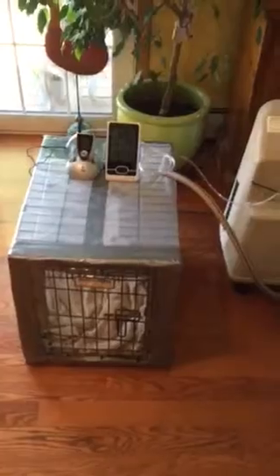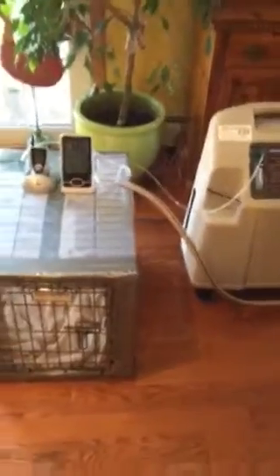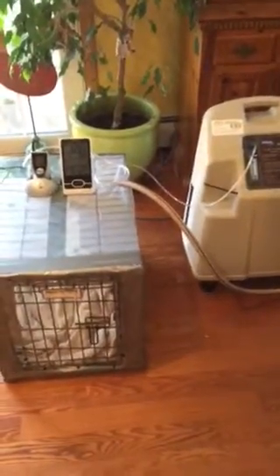So there we go. This is my homemade oxygen cage for my Cavalier King Charles. I hope this helps. Hope it helps anybody out there that may have to bring a dog or a cat home for oxygen therapy. It saves a lot of money. We were paying a few $100s a day just for the dog to have oxygen at the vet.